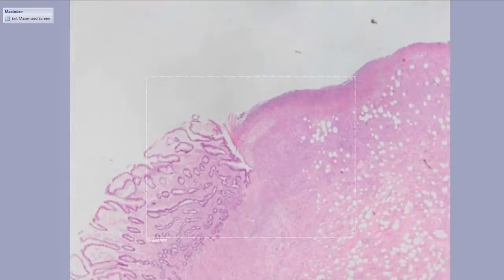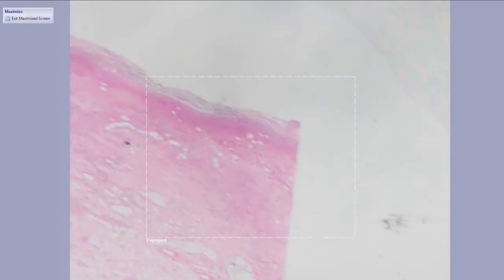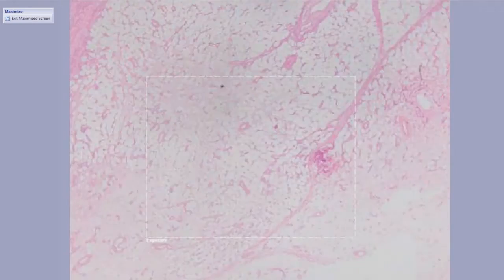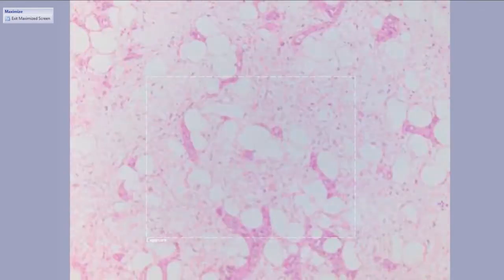This next patient had a large colon mass that was bleeding and causing obstructive symptoms, so they took it out. You can see how ulcerated it is here, and this was in fact colon. That's not small bowel. This is very, very reactive colon mucosa, showing you that this guy was causing a lot of problems, but that's just because he was big, not because he is intrinsically malignant.